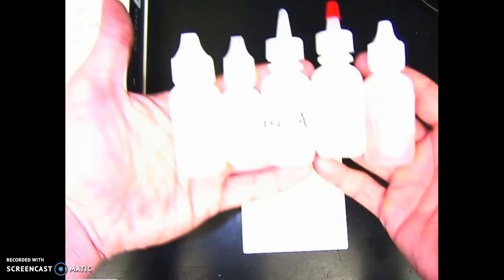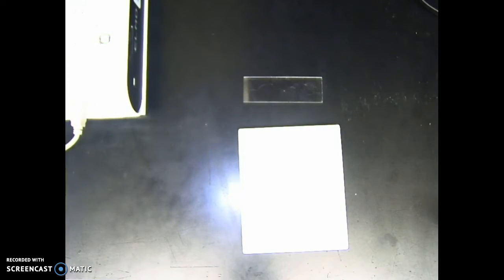All these are generally clear liquids inside the bottles. The only thing you need to know is that if there were a clot, and we talked about what causes clots in the last videos about blood typing, it would be signified by a change of color. I'm not going to go through the results here. I'm just going through the setup.